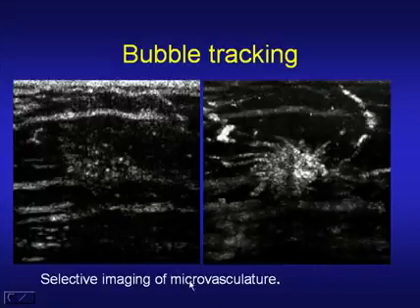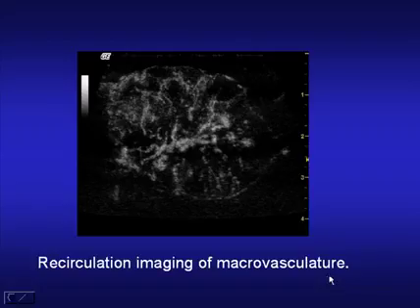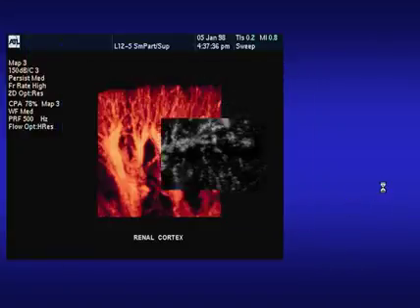And this technique of microvascular imaging, or MVI, as some of the manufacturers call it, is extremely powerful in imaging structures such as the breast and the prostate. It can be applied to larger lesions in the liver, again looking at late phase imaging, looking at the smaller numbers of microbubbles as they slowly traverse the lesion, so we can build up a pattern of both small and large blood vessels within the tumor and see exactly what is happening.